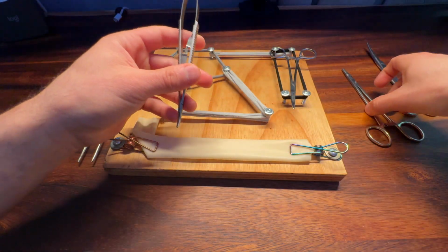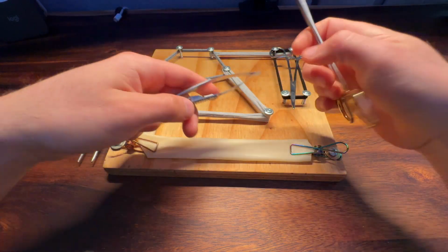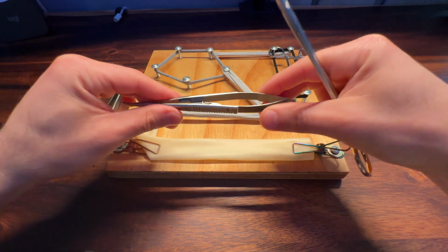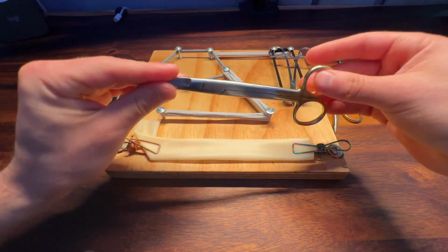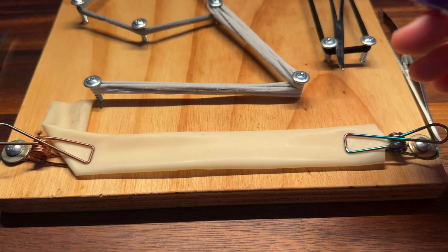For needle drivers, you have two options. You can use a Castro or a needle driver. This is going to give you more precision, especially for those small sutures. So great option here. You cannot go wrong with either one of these. And of course some suture scissors, and here I got some Mayos. Alright, let me zoom in to get started with this technique.